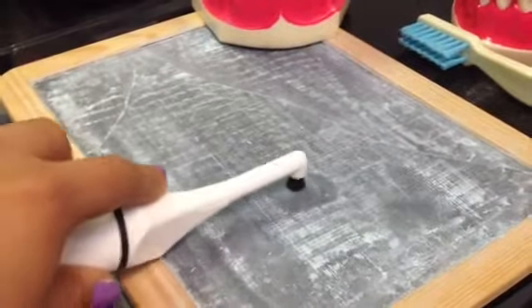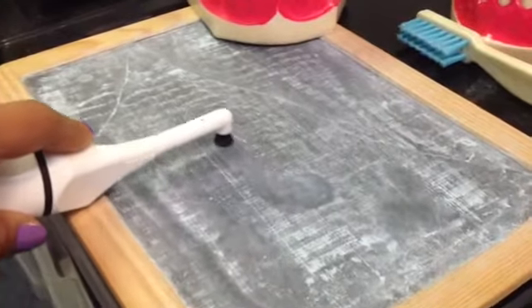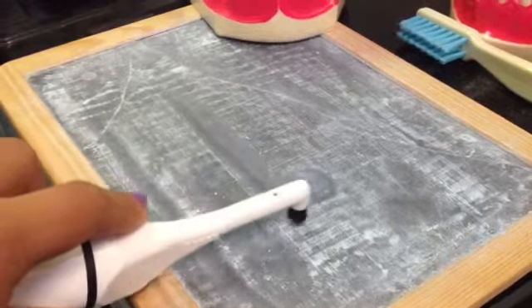You don't have to press hard when you go all the way across. Just go across. See that? You don't have to press hard.